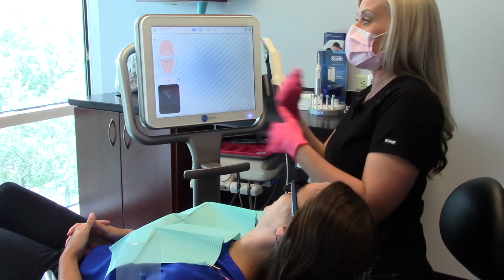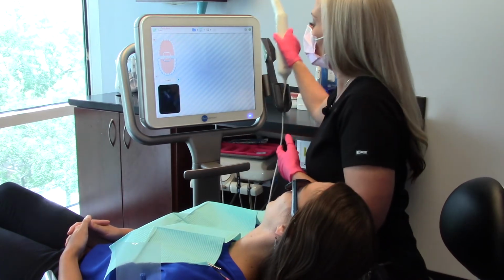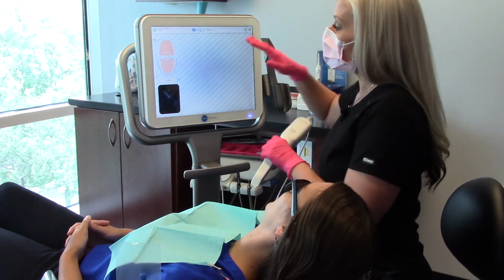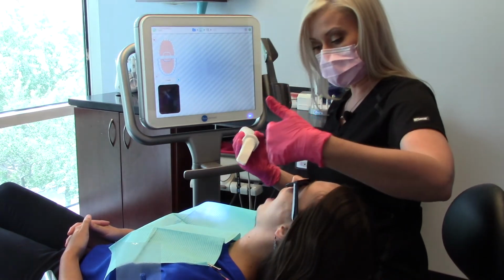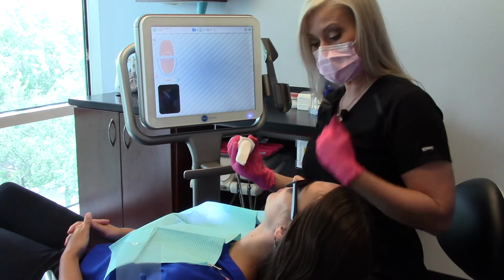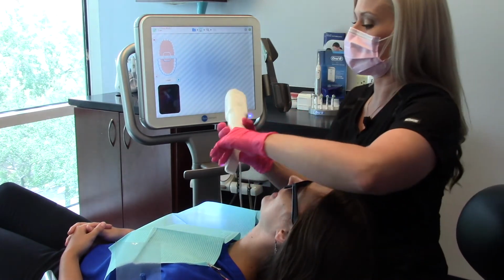So what it's going to do, it's going to take thousands of pictures per second, and it's going to create the mold for us. So what I'm going to do is I'm going to start on the bottom arch, okay? And then we're going to work our way back up to the top. Okay. If you could do me a favor and take a big swallow for me. Try to get your mouth as dry as you can. Excellent.